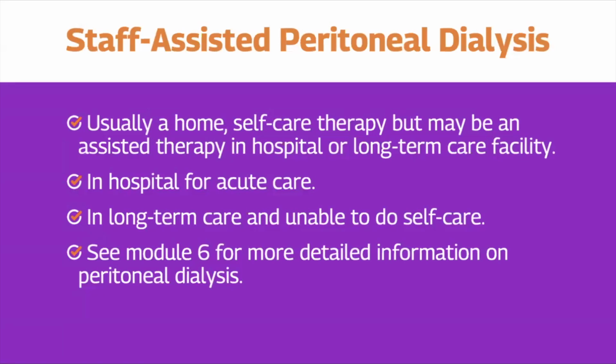So the hospital dialysis staff will do a PD treatment with a machine, and the patient will later be trained to do self-care PD once they are discharged from the hospital.